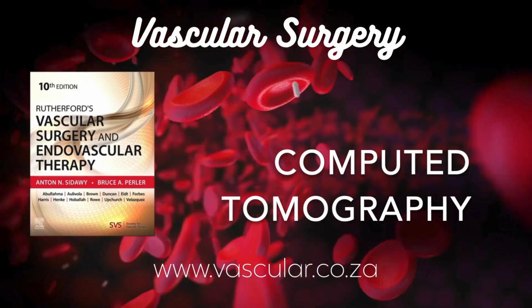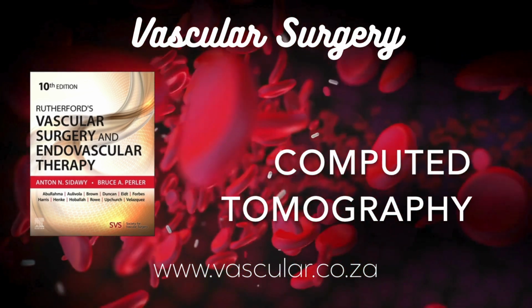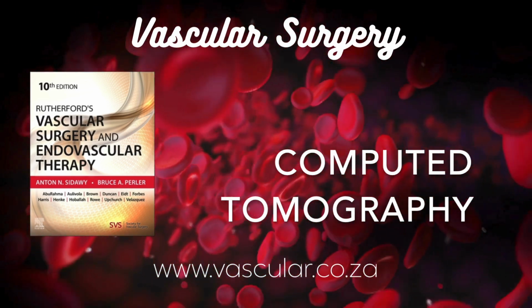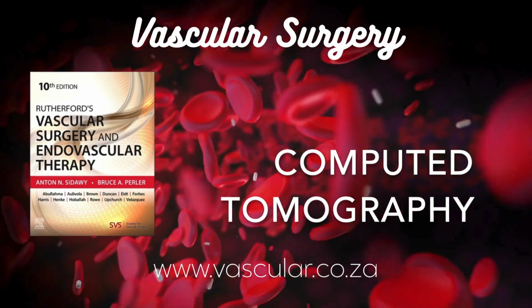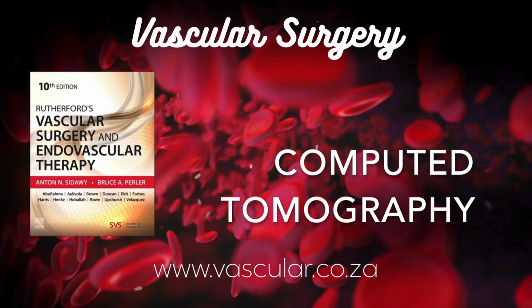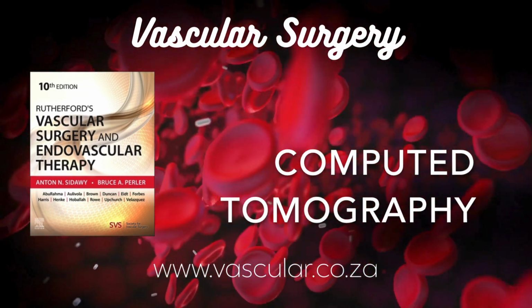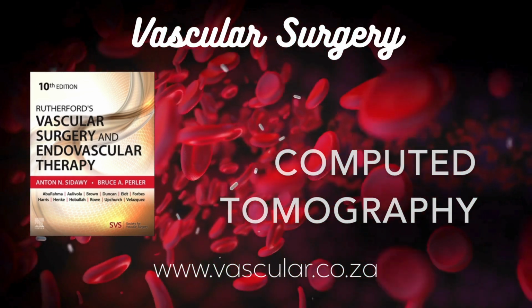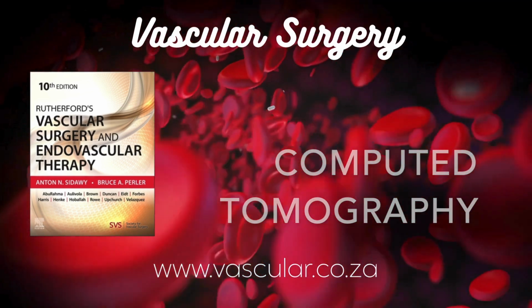What about patient movement? That's probably the most obvious artifact. Any movement, breathing, coughing, just fidgeting causes blurring or ghosting. Double contours? Pulsation from arteries can also cause artifacts. If someone can't hold their breath well, sometimes coaching them to breathe very shallowly and quietly is better than failed breath holds. Any other common ones?